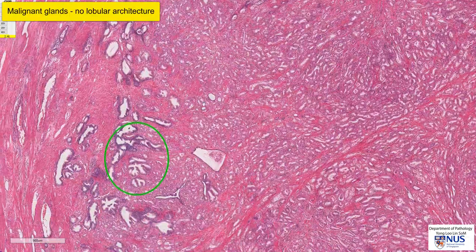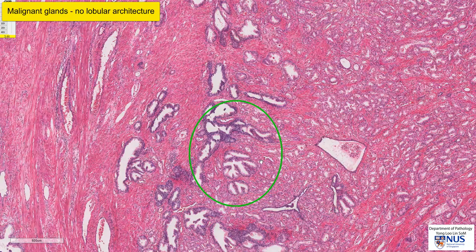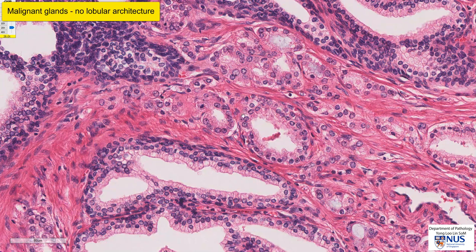Let's move to an area where we can directly compare benign and malignant tissue. Here we have larger benign bilayered prostatic glands, and in between we have malignant glands. For example, we have a malignant gland here, malignant glands all over here, and this is a benign gland.